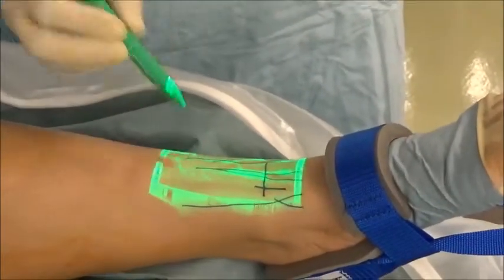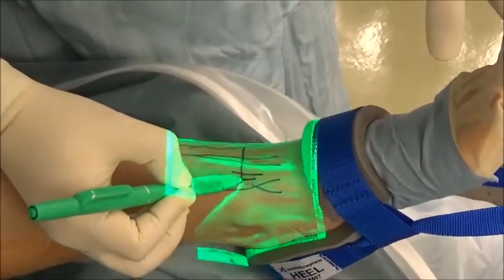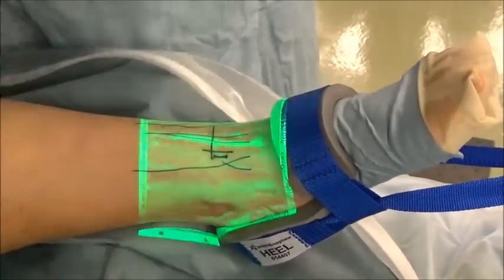The veins are visualized with the green light on the skin in the inverse and fine detail mode. The veins around the anterior medial portal and anterior lateral portal are marked with the skin marker.